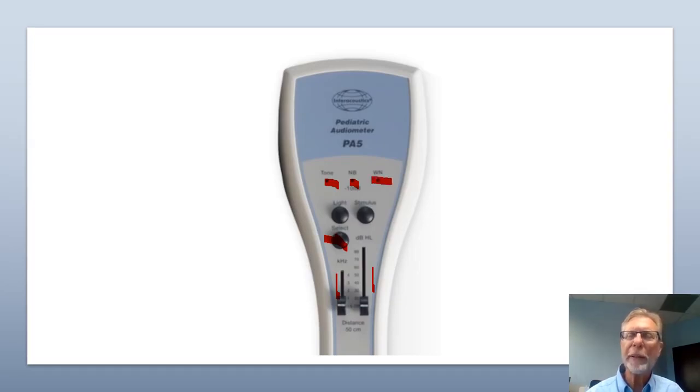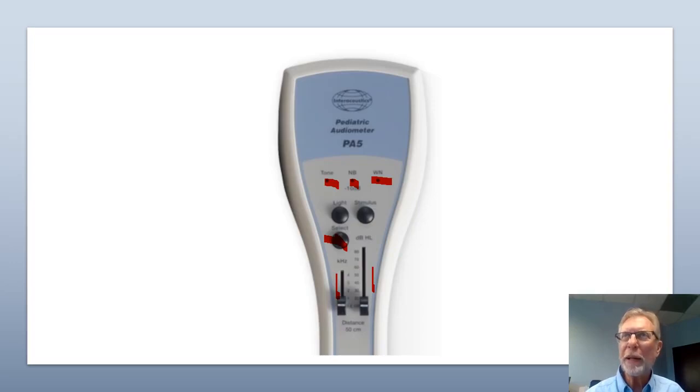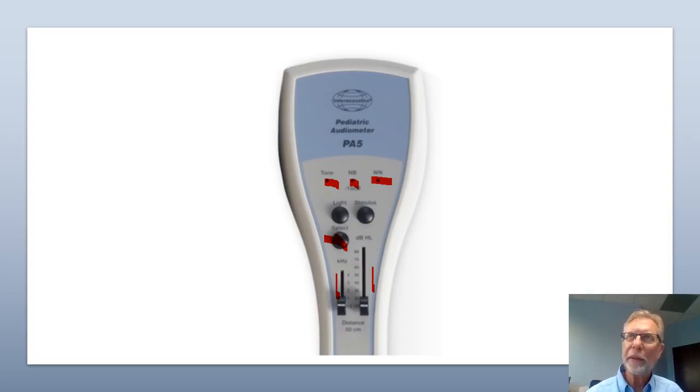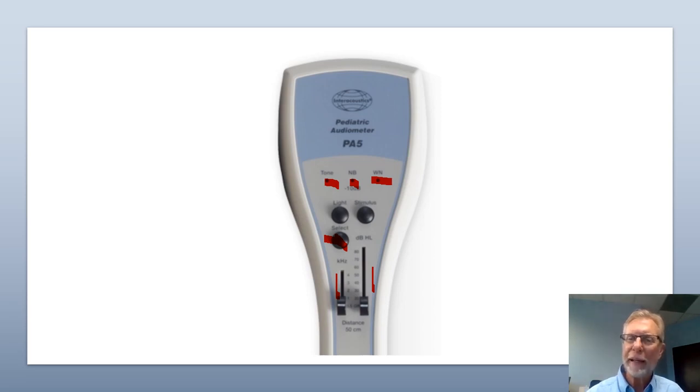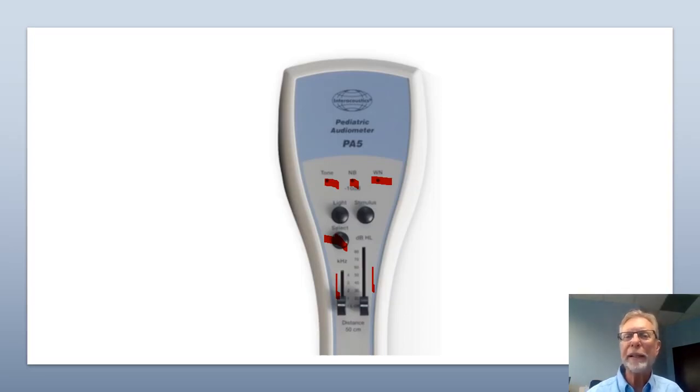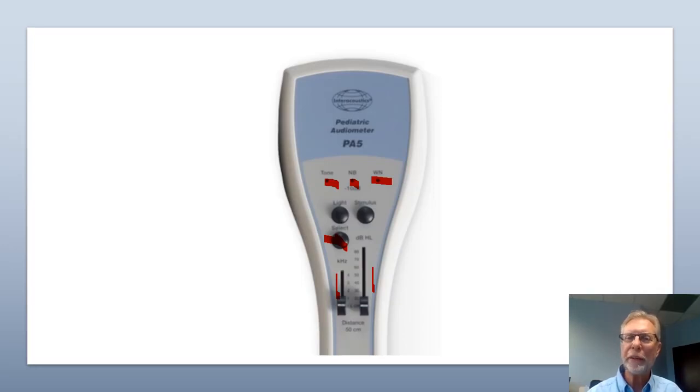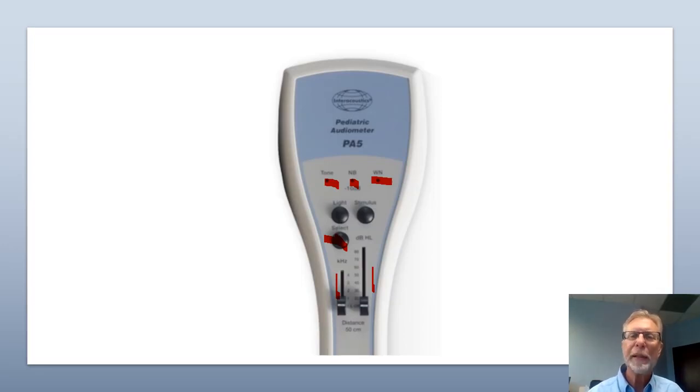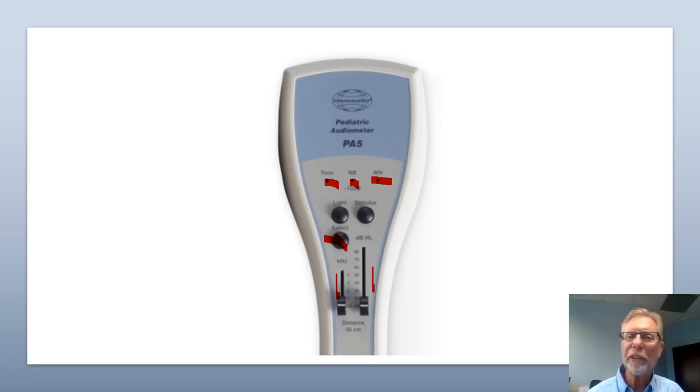When would you use narrow band? Well, narrow band, they might respond better to narrow band. You'll use those instead of the tones because the narrow band of noise will change for frequency and level. And you would use narrow band instead. However, the narrow band is a little bit lower. So you can let them pass. It says minus 10 under it. So you can let them pass at 30. Narrow band is just an alternate stimulus that sometimes pediatric patients respond to better than tones.